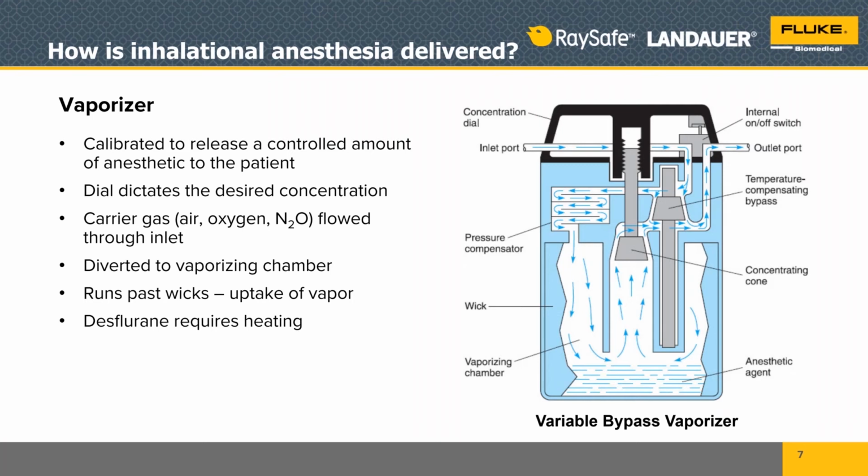And if you tip this over too much, you can throw off the calibration of that wicking system. So you don't want it to go past a certain angle. So these things have to sit flat. They're heavy, so they're wheeled around with carts. These are just unwieldy instruments that can be dropped, but basically their function is pretty simple, but things still can go wrong with them. And again, critical that this thing is doing the right job because it is in direct contact with the patient, right?